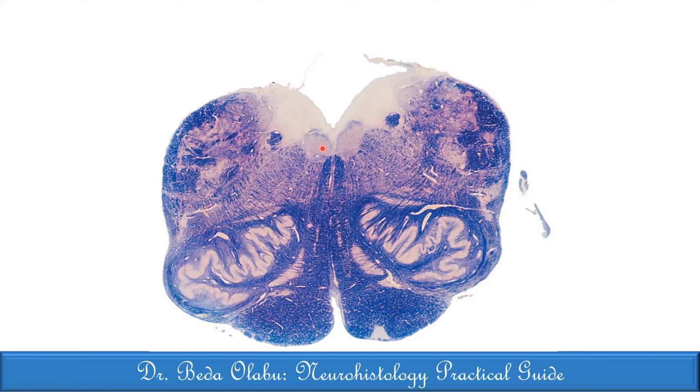It could be gracile nuclei or it could be other things. But there's a nuclei there. Let me say that. What else posteriorly?